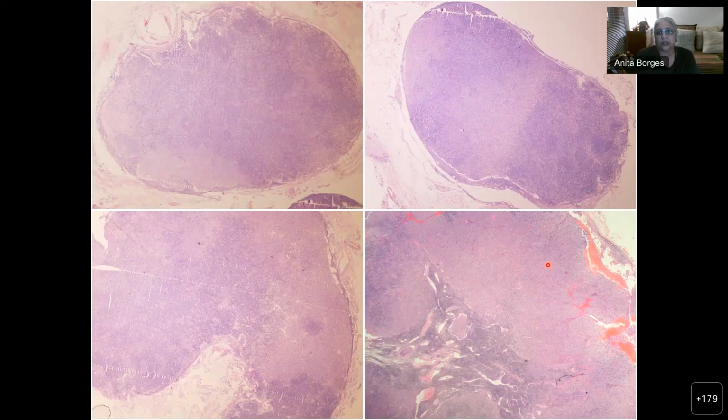Number 3. Now here, there are no prizes for guessing this because you can see these pale areas that have, in some cases, almost bisected the node. One side you get pale areas, the other side something that is follicular. This was a biggish node, and many sections were taken. You can see a large pale area there, and here as well, occupying almost the entire node and leaving just the medulla intact. You can see beautifully the medulla of the lymph node over here.